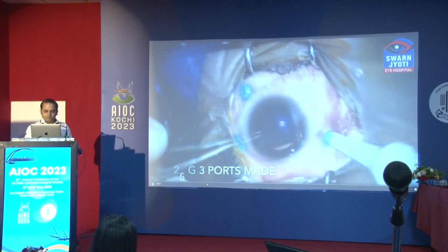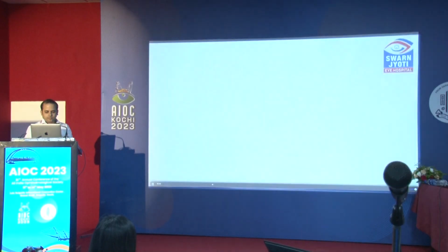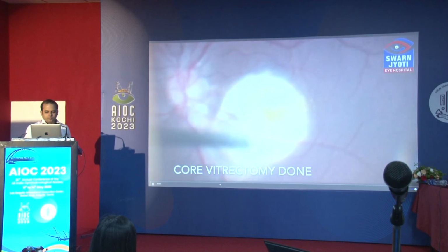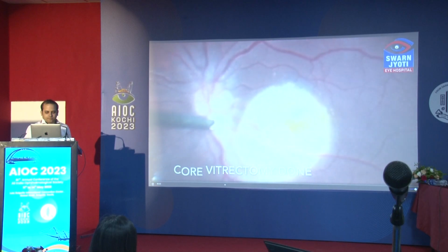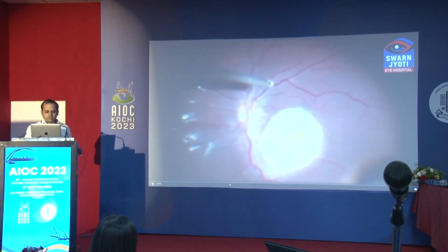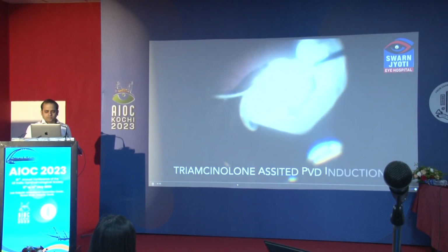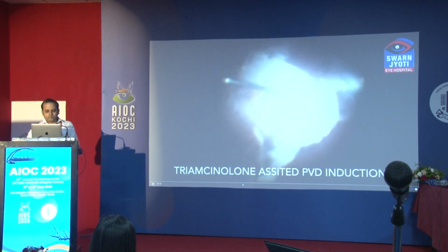25 gauge 3 ports were made. Core vitrectomy was performed, and if you notice keenly, the classical undulating movements can be observed here. PVD induction was tried first without triamcinolone. Then triamcinolone assisted PVD induction was successfully done and a complete vitrectomy was performed.